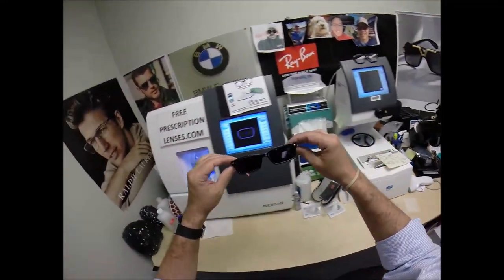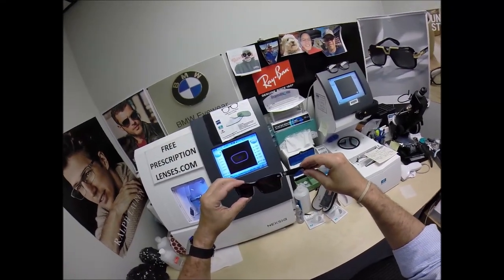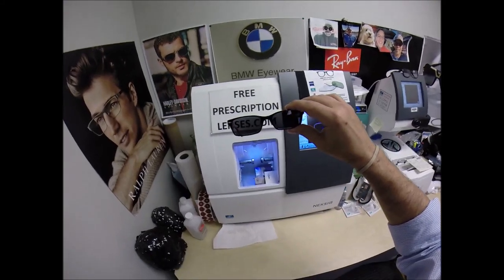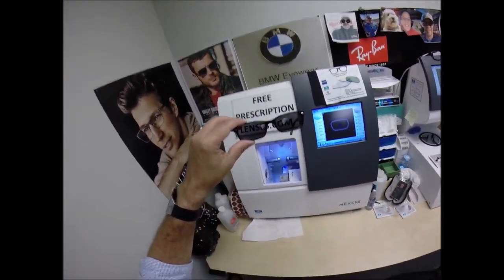The only time they won't work is if you're behind the windshield of a car. Your windshield absorbs the sun's harmful ultraviolet rays that would cause your dashboard to crack from sitting in the sun all day, and that's why they don't turn dark in a car. Now, if you have a convertible or a motorcycle, they will darken.